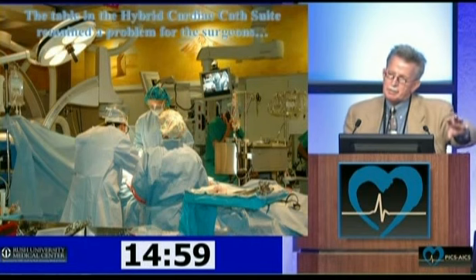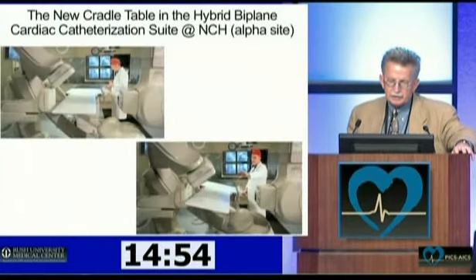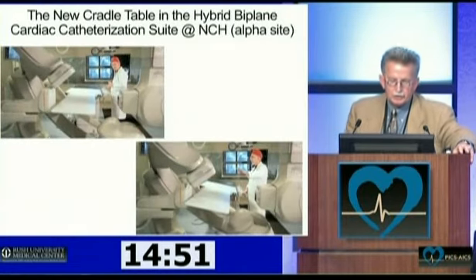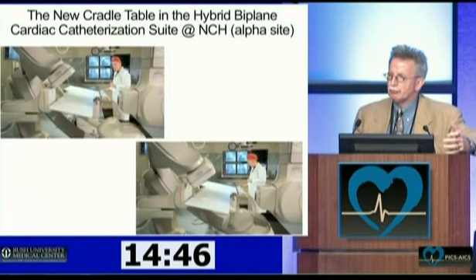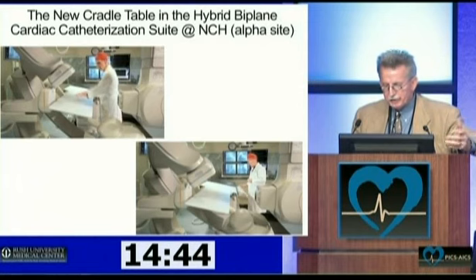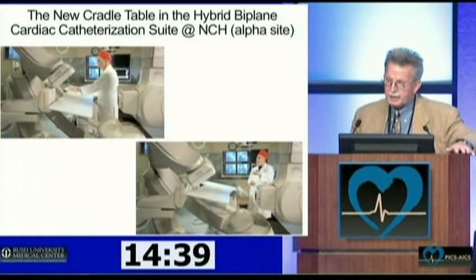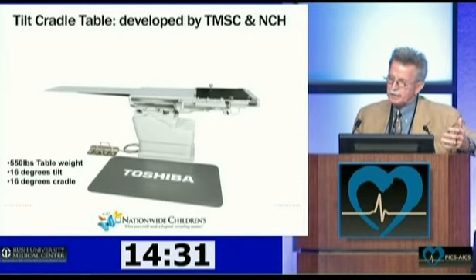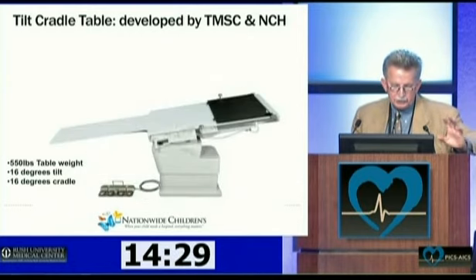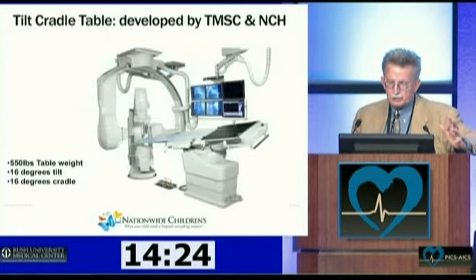But we get back to our hybrid cath lab, and we kept saying, well, the table still is a problem. So we took this idea, and we went to the engineers with the input from the cardiothoracic surgery and the interventional team, and said, we need the table to do certain things for the surgeons. We also found out that if the table actually cradled and tilted, just like an OR table, we could actually get more complex angles as well. So what we came up with ultimately was a cradle table, and you can see that it actually holds more weight than the standard table, and the 16 degrees tilt and cradle that it does in complex angles. And you can see either in a single plane or a biplane room.